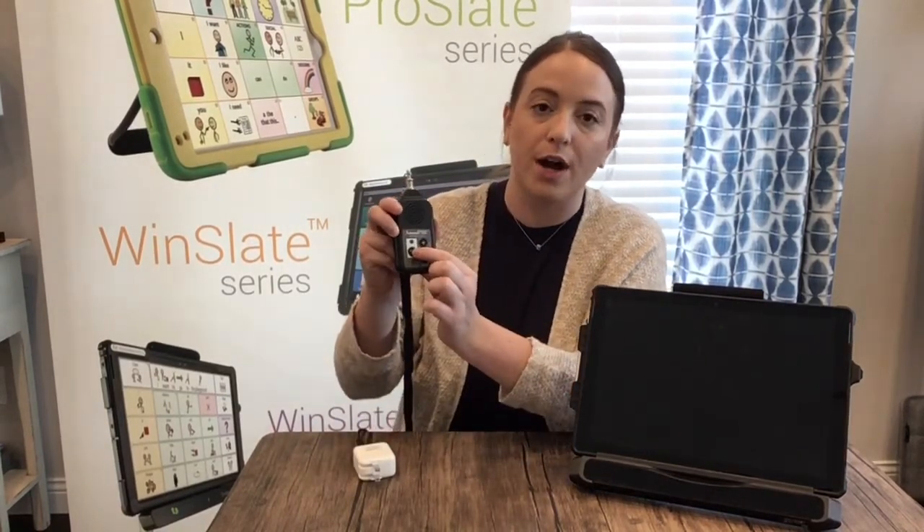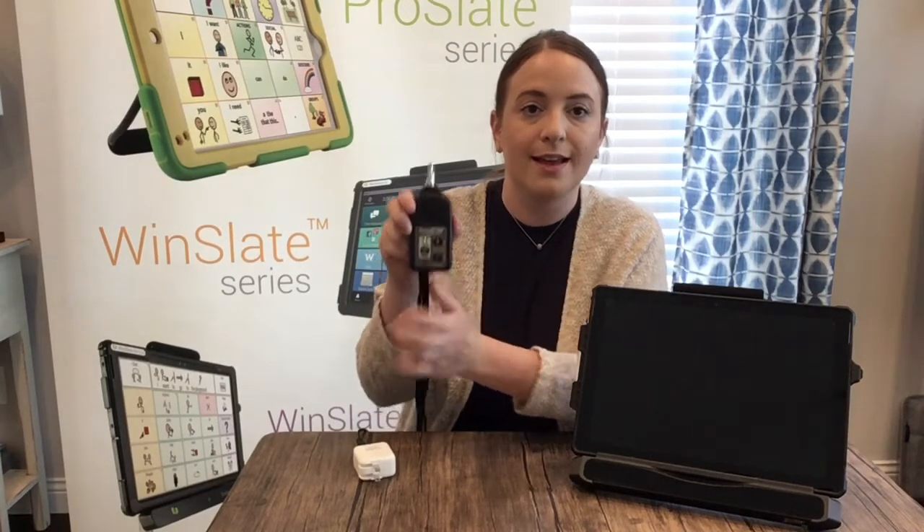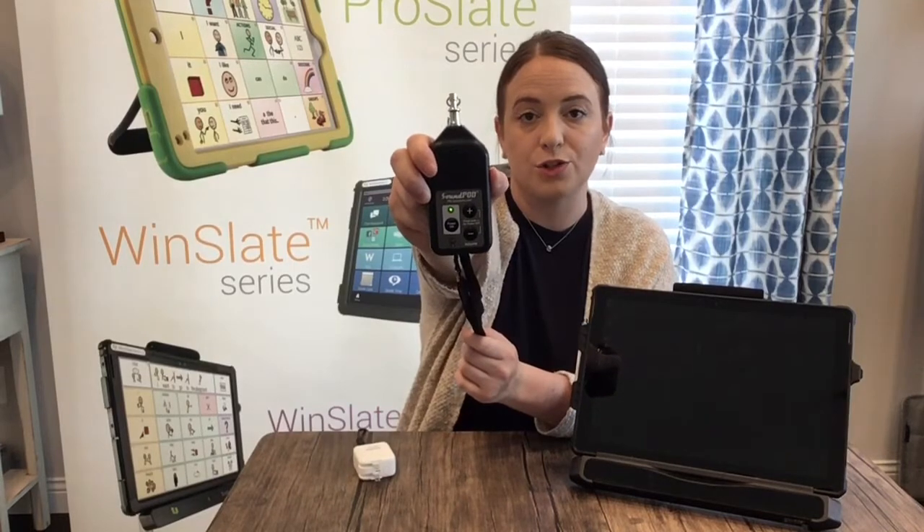To turn it on, you're going to find the power on button. Go ahead and hold that down and you're going to look for a green light. You see that green light? That's how we know the sound pod has turned on.